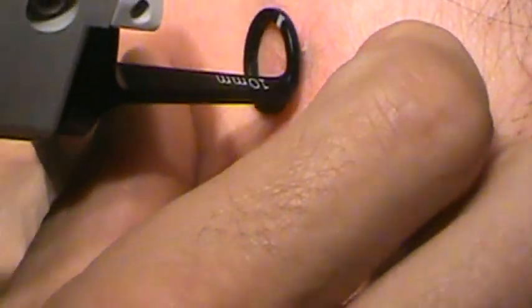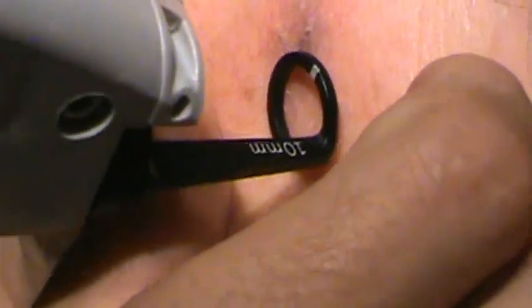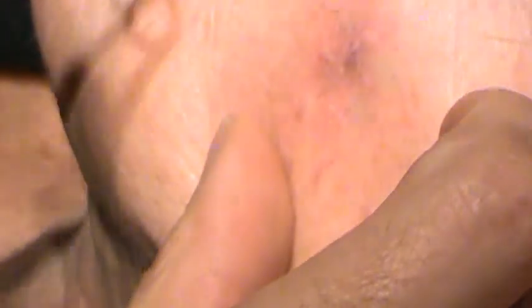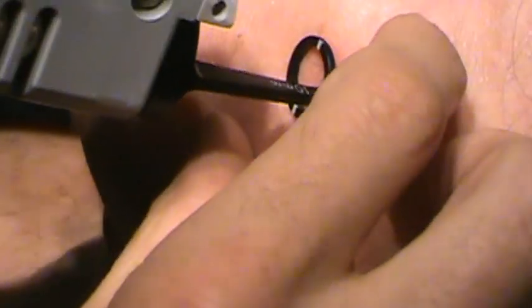That turned purple pretty nicely, so let's just hit the area around it. How's that feeling? Okay, great — that's all there is to it. What's that mark called? It's called a papular telangiectasia, or a dilated blood vessel with a bump on it.